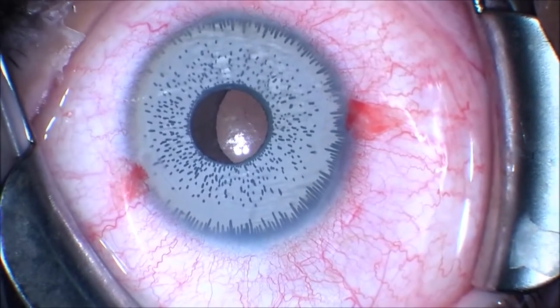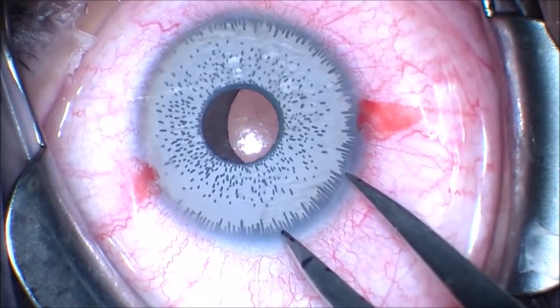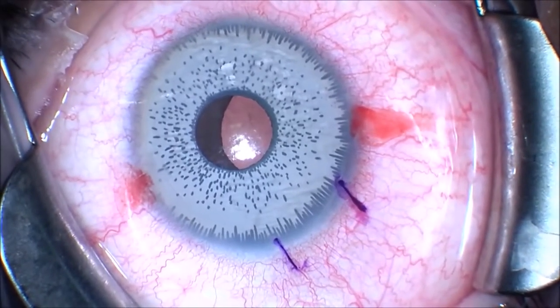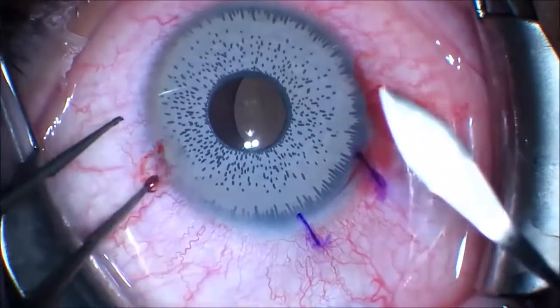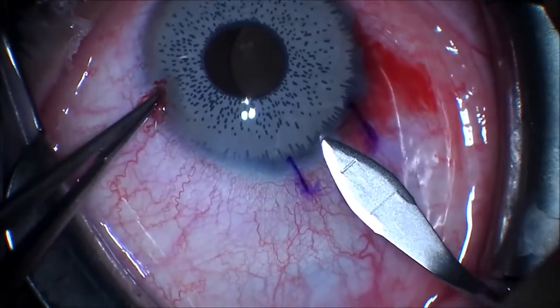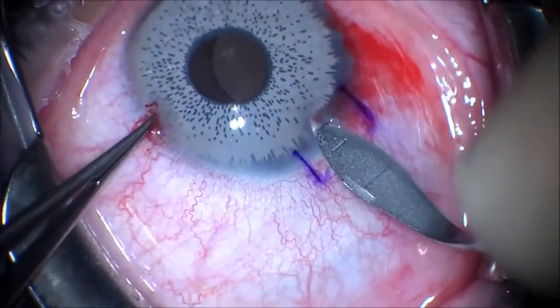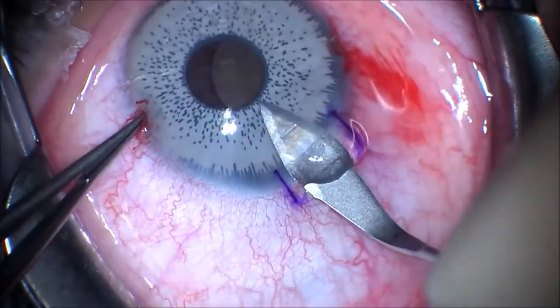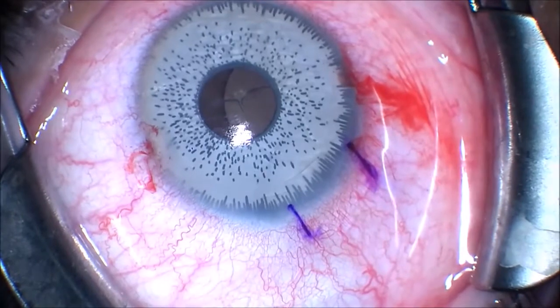We've already made two paracentesis incisions superiorly and inferiorly, and we're marking a 4 millimeter length along the corneal scleral limbus to give us the final size of our corneal tunnel. We are going to enter the cornea at the limbus with a 2.8 millimeter blade, being very careful when inserting the blade into the anterior chamber, using a controlled type incision so as not to damage the lens. This patient is phakic.